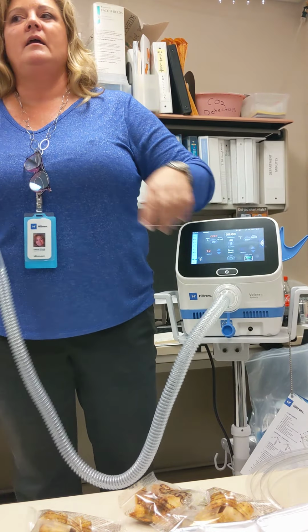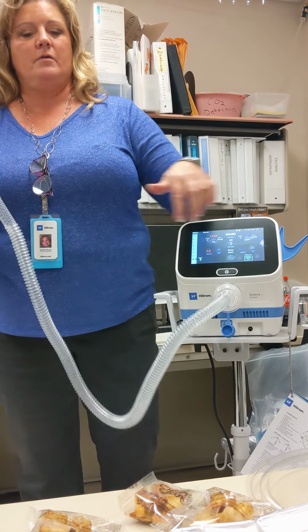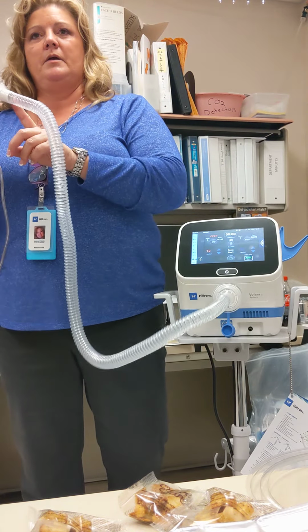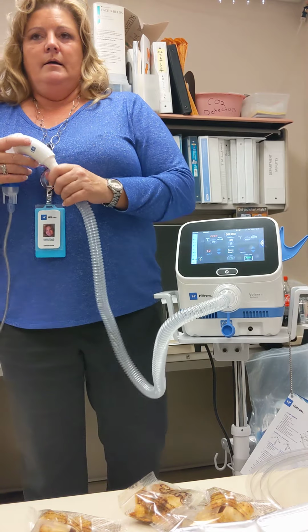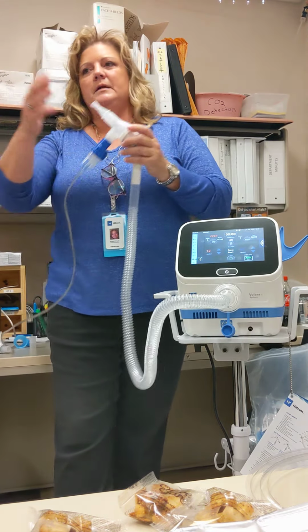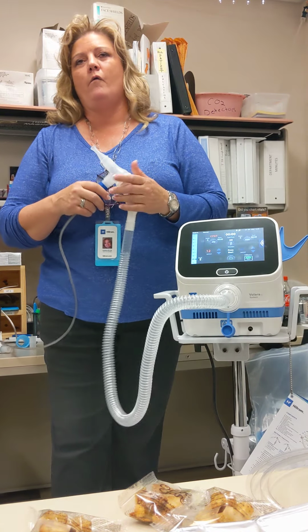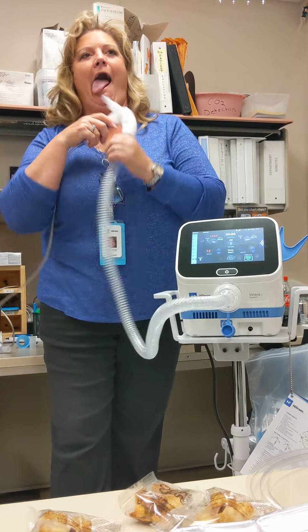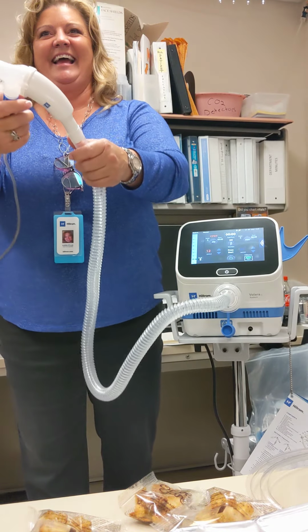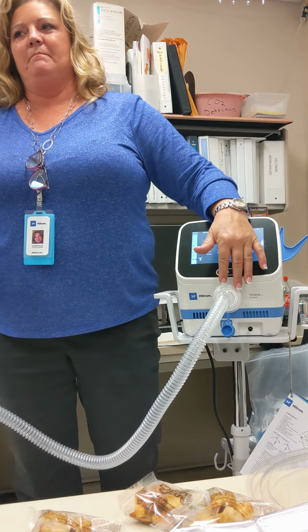Just know if you had someone who's really goopy and you want to put in another filter, you can put it in up here. I've seen people put it up here. You can put a different mouthpiece, so you guys can all use one circuit and go on. We can't do that anymore because of COVID. You don't need to use a HEPA filter or anything because it's their own circuit.